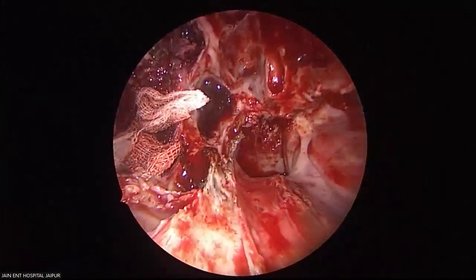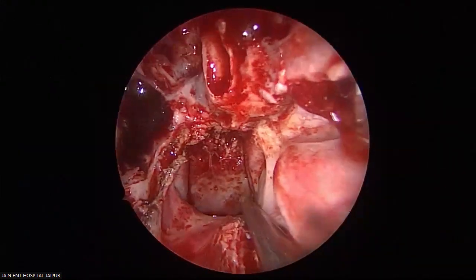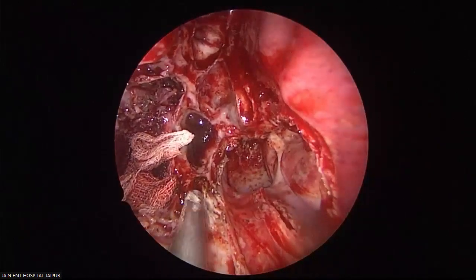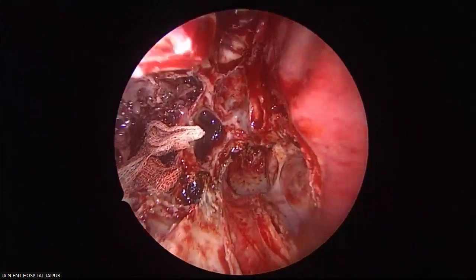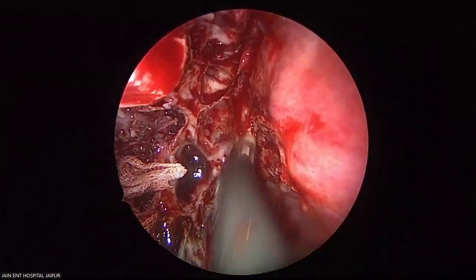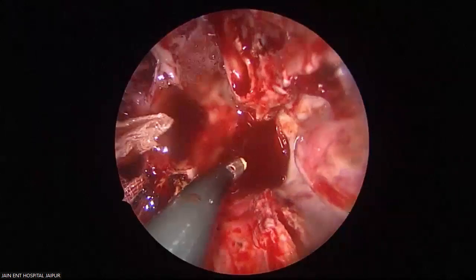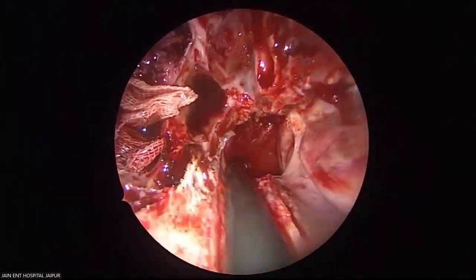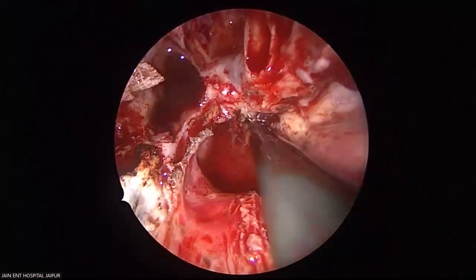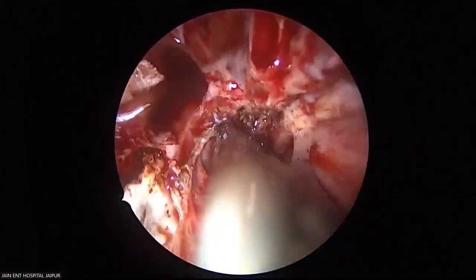See now the nasopharynx. See the adenoid surface, which is always free. Adenoid surface is always free. No bleeding at all. Excellent view. Good job. Now, precautionary, I have already done. See now what I am doing? Coagulating the nasopharyngeal roof periosteum.